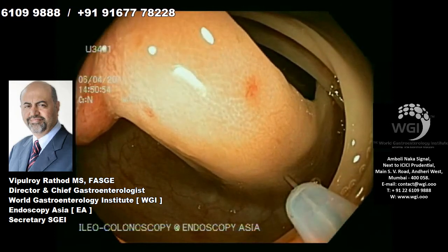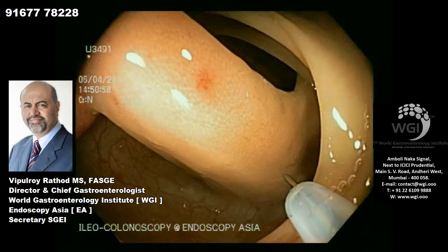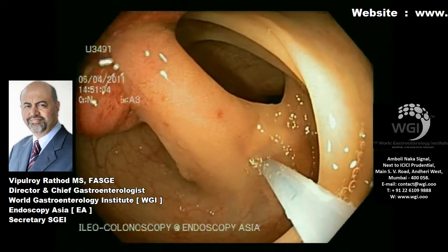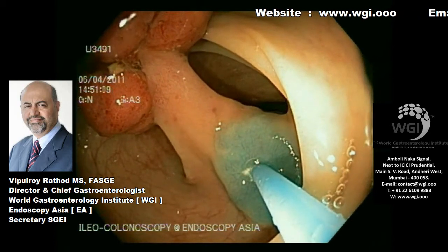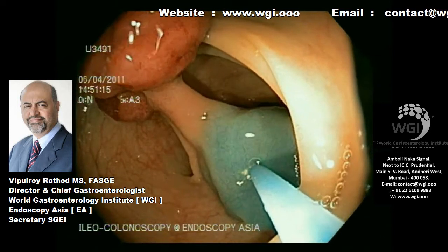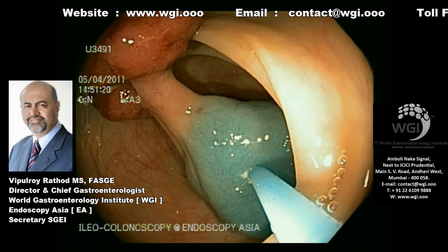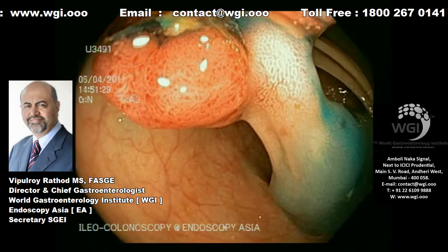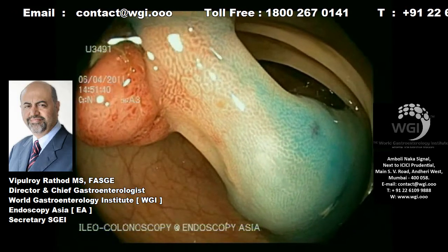You can see here we are using a 25-gauge needle to inject the base of the polyp. Once you start injecting, you will see a submucosal bleb in the base of the polyp — you can see that very clearly. This is a standard technique which we use for management of colonic polyps with a stalk, or even flat adenomas.